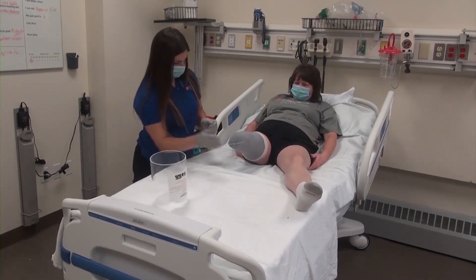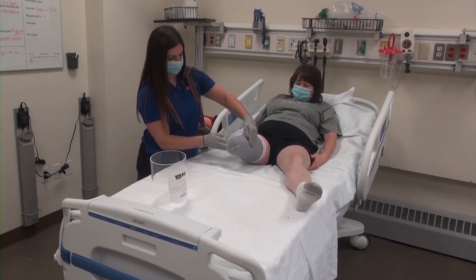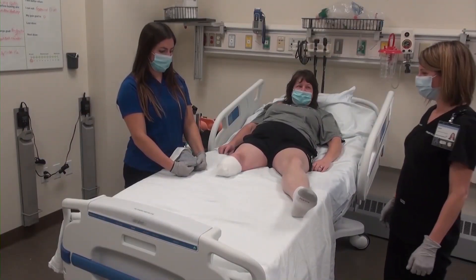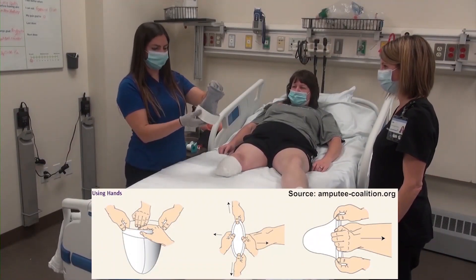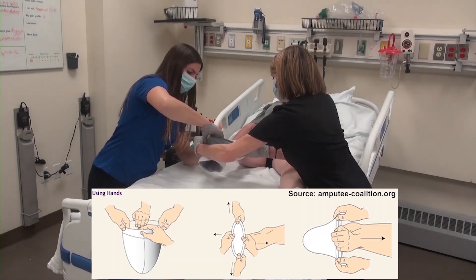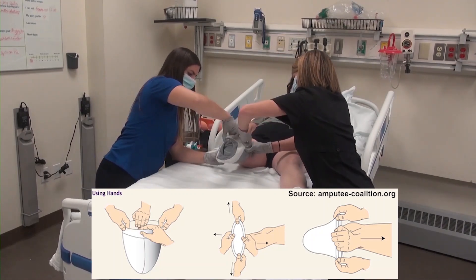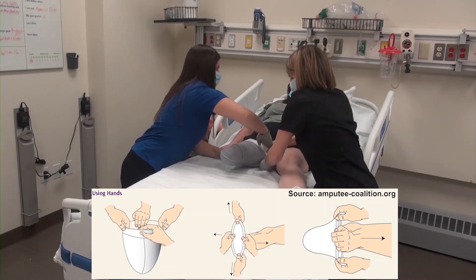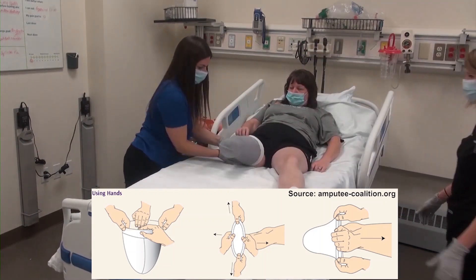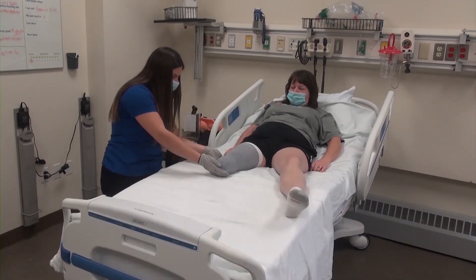If a donning tube is not being used, the forehand method should be used. This requires two people — either two medical professionals or one medical professional with help from the patient. In this method, one person will pull the top of the shrinker horizontally while the other person or patient will pull vertically to get the shrinker opened as wide as possible. From there, gently slide the shrinker onto the patient's limb, checking again for wrinkles and excess shrinker material at the distal residual limb. The silicone beads at the top will assist in preventing distal slipping or migration of the shrinker while the patient is wearing it.